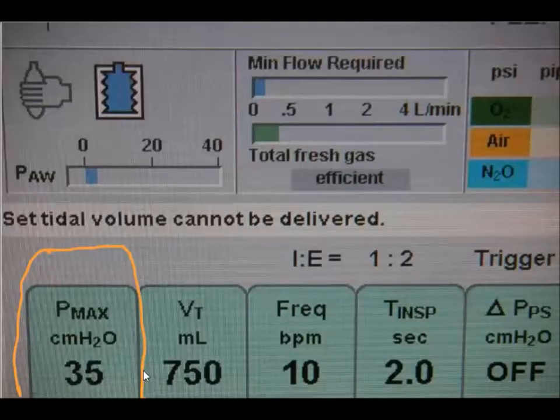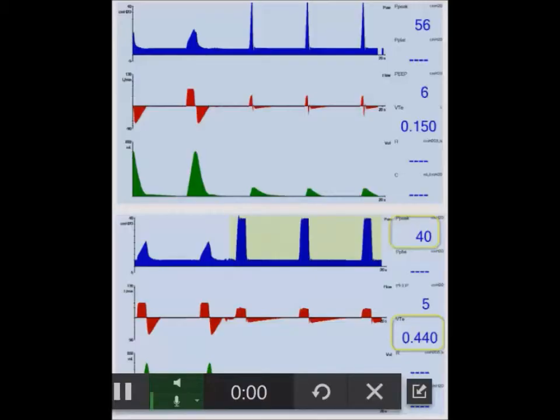It's not really a separate mode in the Apollo system, or in a couple of Draeger ventilators also, where PMax is used with the volume control modes, so it's an option one can turn on. The advantage of a dual targeting scheme, specifically pressure limited or PMax, is that it can adjust to changing patient conditions and it ensures a peak inspiratory pressure.